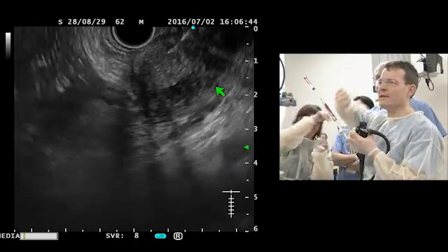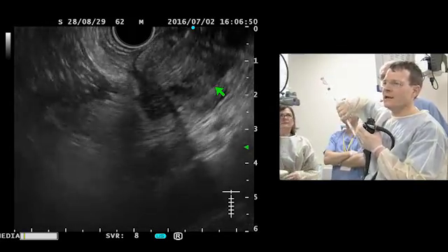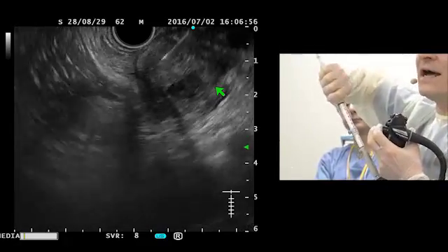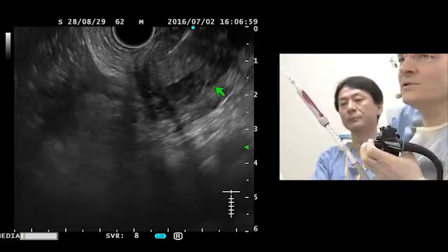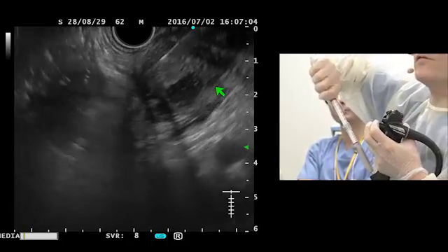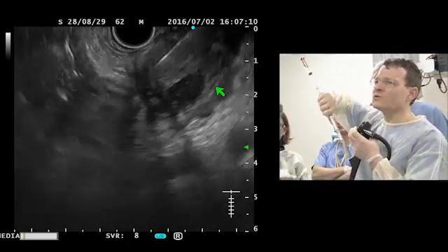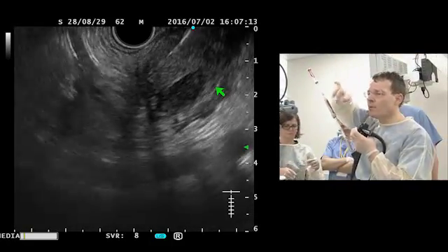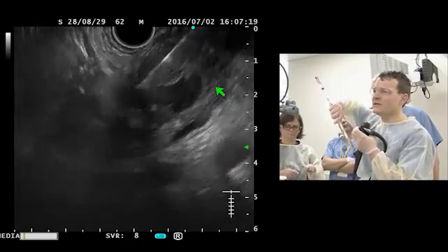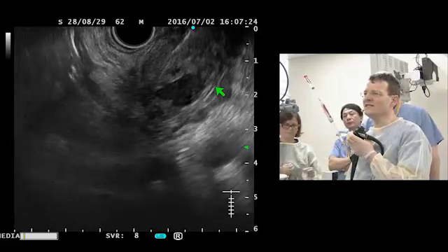So now we put some negative suction pressure, and now I'm trying to grab tissue, and now I do relatively forced movements, because when I don't puncture with enough force, then the tumor may move and I don't grab material. So the important point is to grab material, and I also try to stay within the borderlines of the tumor, so that I don't extend the needle beyond the tumor. So what I notice here, that I'm relatively fixed in the tumor.